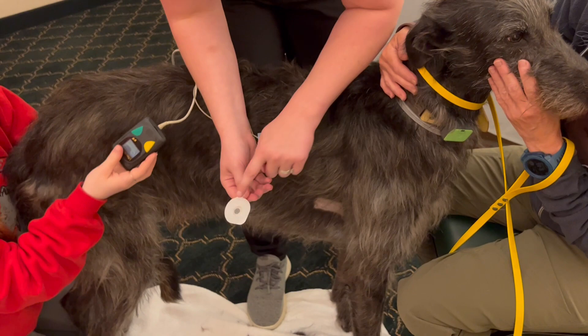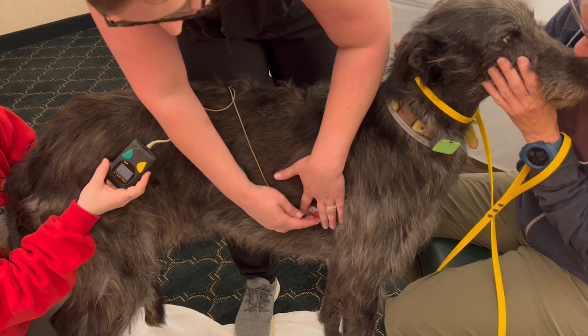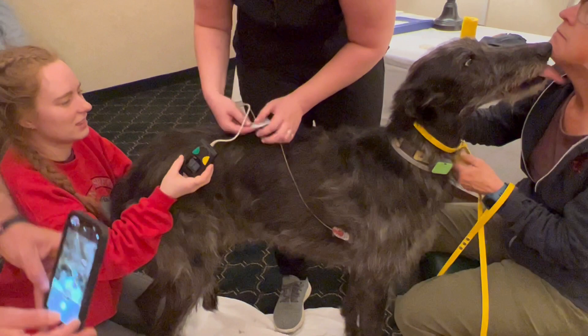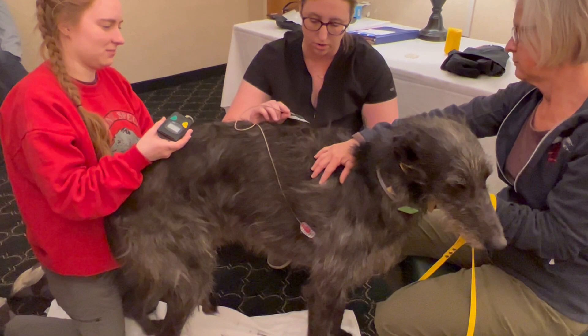There's a little bit of gel for contact already there. You can just remember: red on right. And then that just needs to make contact with the skin — just gentle pressure and that's attached. If the skin is dirty, they don't stick as well, so sometimes it's good to wipe that spot down with a little alcohol or soap and water, but make sure it's very dry before you try to put anything on it, because water or dirt will prevent them from sticking.